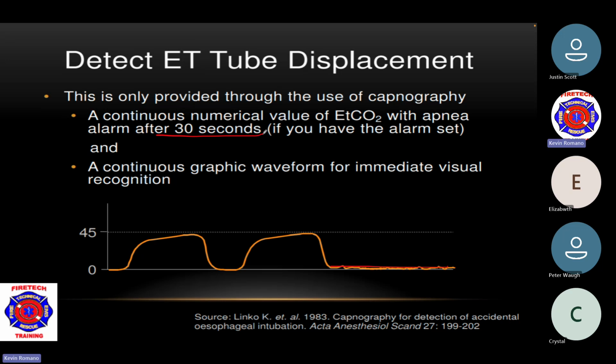When you start shutting off alarms on your cardiac monitor, because you don't like the recalibration SpO2 alert that's on there, you're disabling all your alarms. Therefore, your apneic alarm will probably just blink a light and you won't even know what's going on. So keep that in mind.